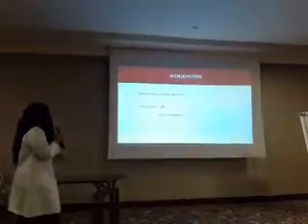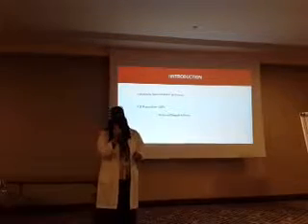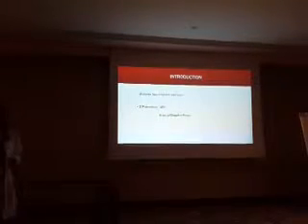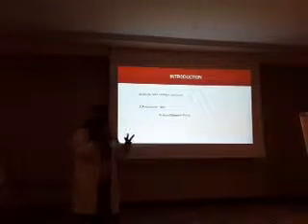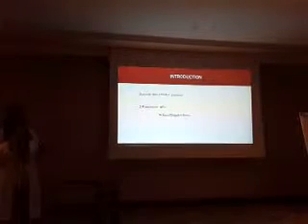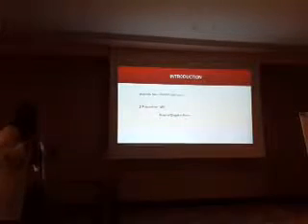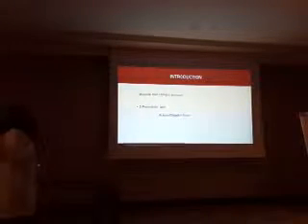To be able to do that, I will explain our protocol. Our protocol in King Faisal Specialist Hospital is especially designed for diabetic foot, if you heard about it, and it is established for all arterial examinations. It must be done using two machines, an ABI machine and an ultrasound Doppler. We cannot exclude one of them. They should be combined. Any request asking for claudication, ischemia, obstruction, or peripheral artery disease, you must do arterial Doppler and ABI.